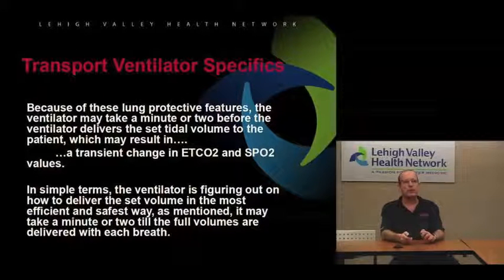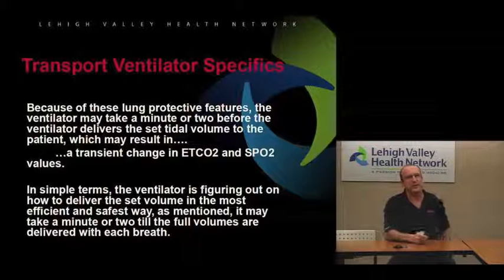Now, because of these protective features of the T1, it does take a couple minutes to deliver that set tidal volume. Like, let's say we're giving volume type breaths. So initially, when we switch the patient over from another ventilator or even from a bag valve mask to our transport ventilator, and it's the T1, there's probably, more likely than not, going to be a transient change in the end tidal and the SpO2.